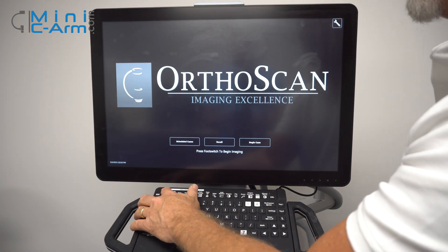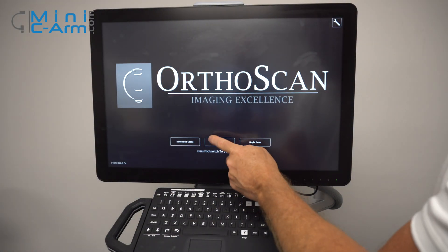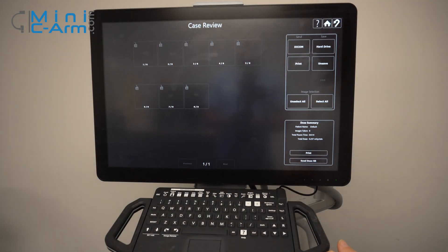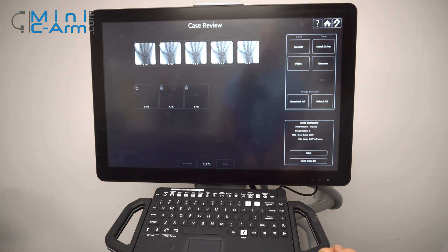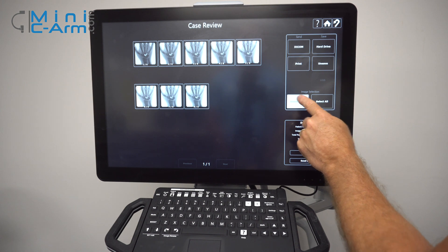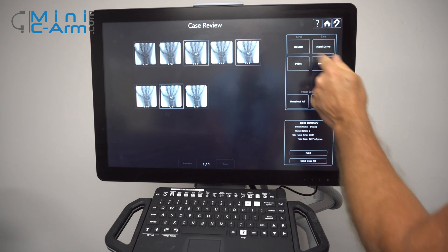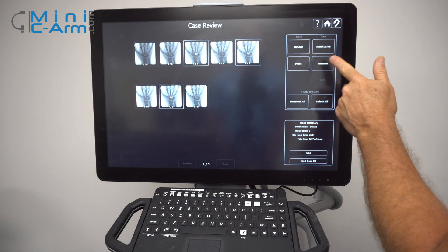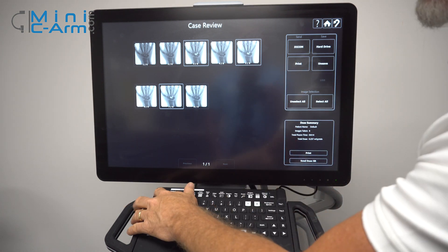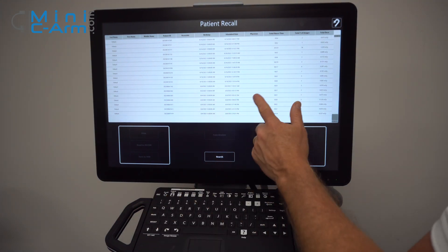Here's your recall screen. You can either access it through the keyboard or the touch screen. You can double tap on a case and it'll open up for you. Over here you can select all, unselect all, or choose which ones you would like. You can send it to DICOM, save it to your hard drive, unsave it, and print. To get out, just press escape once to get back to the patient recall screen, and one more time to get back to the home screen.